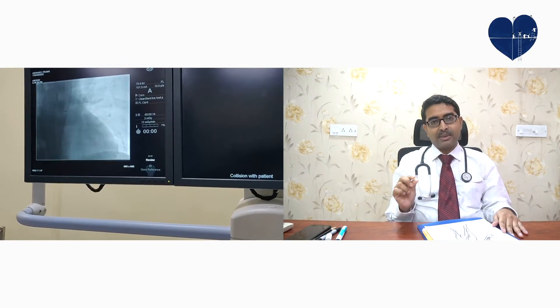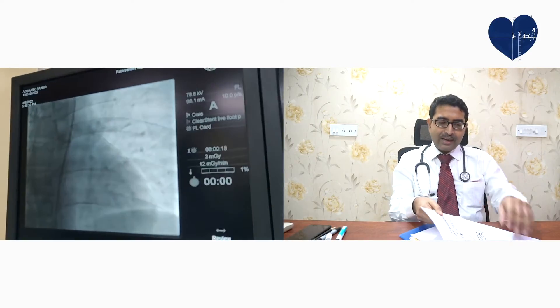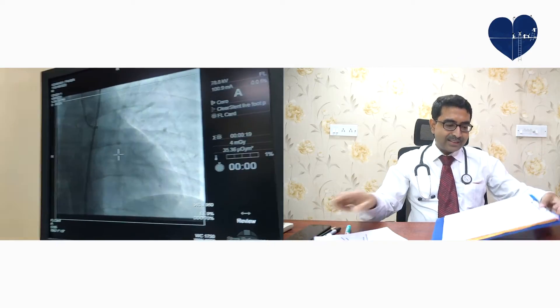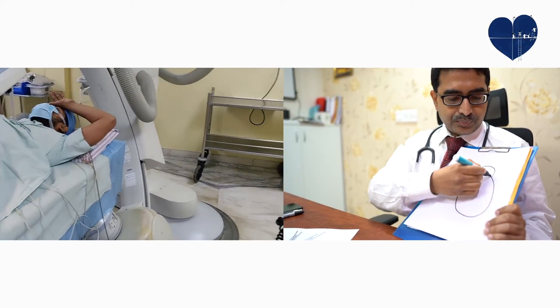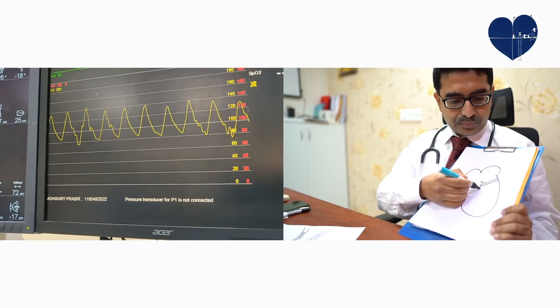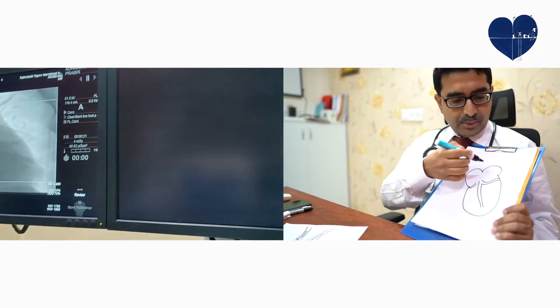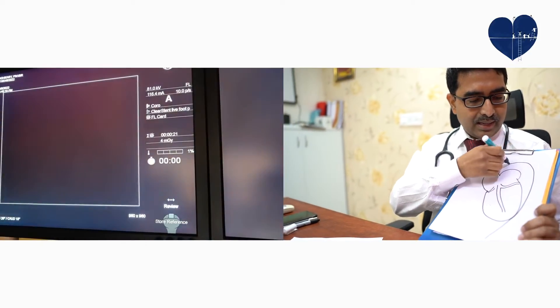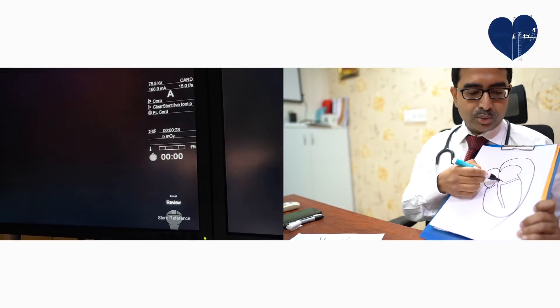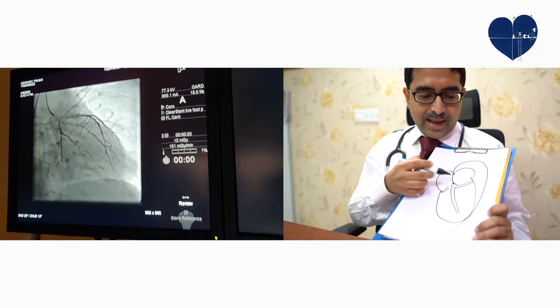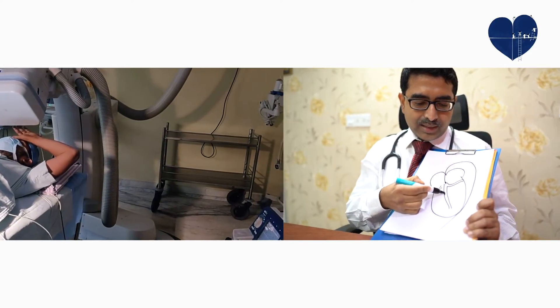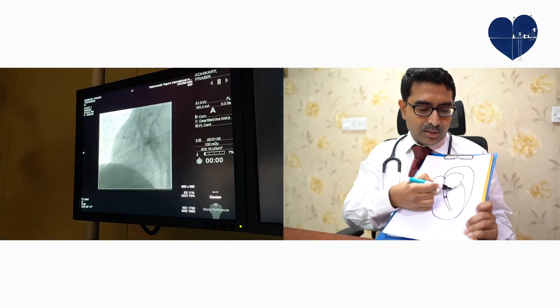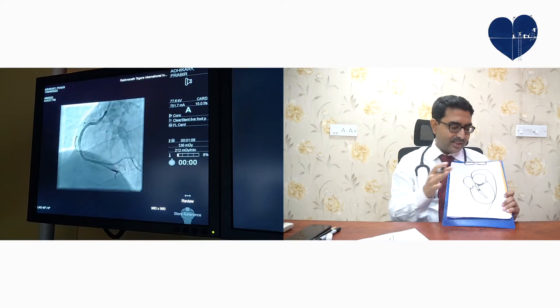We assess whether there are any blocks, what the percentage is, and what the length is. With the catheter sitting in the ostium of the coronary arteries and the dye flowing through, we take pictures. If there is a block — even a long block — that will be clearly detected. These are all painless steps; there is nothing to be afraid of.